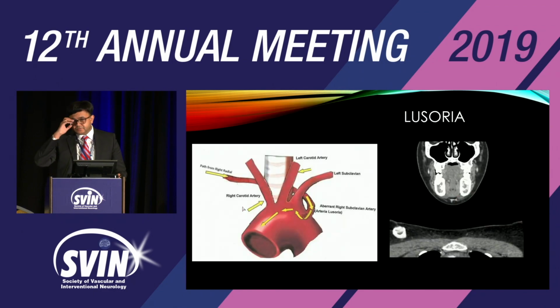As Dr. Rakesh was saying, it can get a little bit tricky. So for the young trainees, this is an aberrant artery here, where instead of coming from the far left, the right subclavian is the last vessel originating. So if you're bringing your catheter, it's going to go into the descending aorta for the most part. You may catheterize some of the left common and right common, but it's very hard to get into the internal coming from this acute angle.